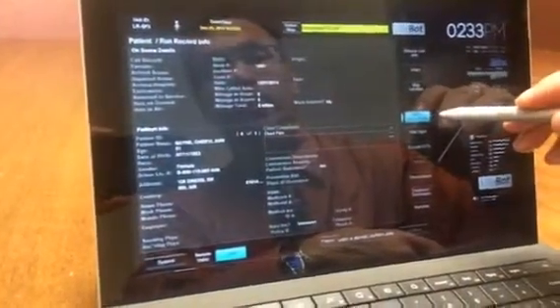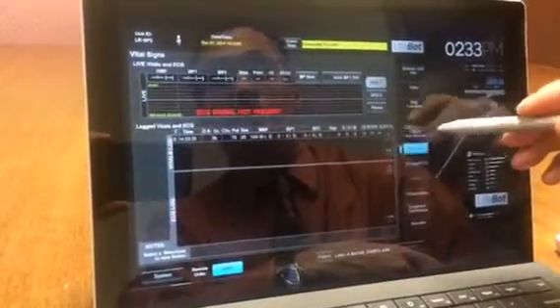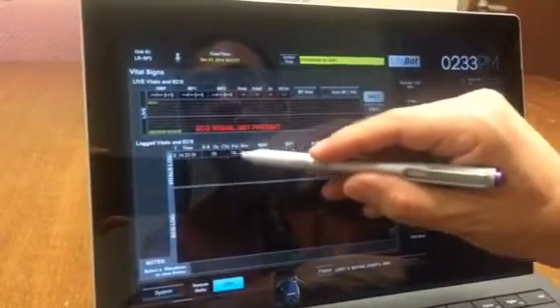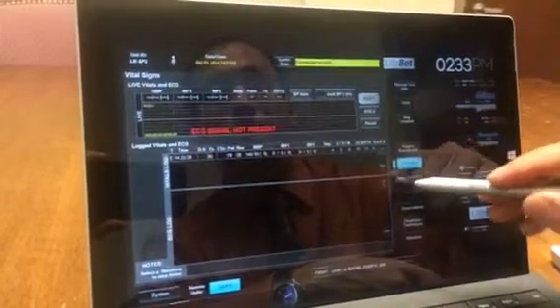The patient run record will show the patient's chief complaint. In this case, it is chest pain. So the patient run record, make sure you get that button. The patient run record button gives you the chief complaint. The vital signs give you, of course, a set of vital signs which are seen right here. Pulse ox at 95%, pulse of 78, blood pressure 146/80.